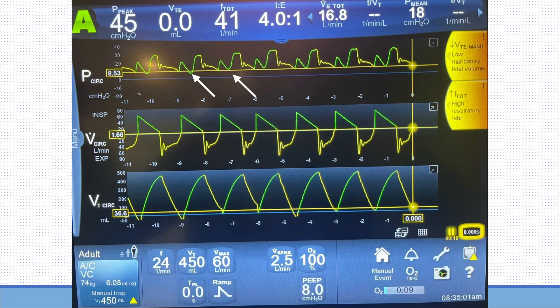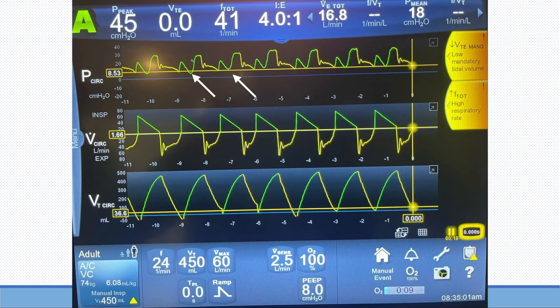Looking at the second breath, you can see that the patient is initiating the breath — there is a drop in the inspiratory pressure, so he triggered the ventilator. Once triggered, the target is to deliver 450 ml and the machine will utilize any pressure required to overcome the resistance and elastance of the lungs. However, the patient can also breathe during this — if the patient breathes, he drops his intrathoracic pressure and the machine doesn't have to supply that pressure. Initially the pressure went up to around 20–22 cmH2O, but then you see a drop, and the pressure falls below the PEEP level. At the end of inspiration, it looks like the patient stopped breathing and the ventilator had to go up to around 30 cmH2O to deliver that volume — this is an inspiratory effort by the patient.